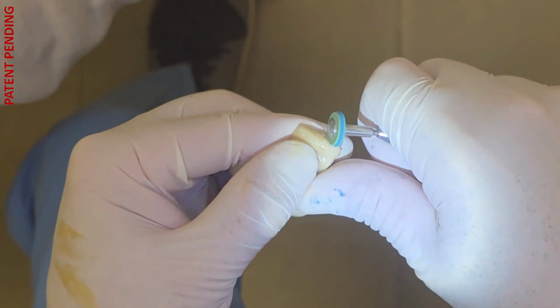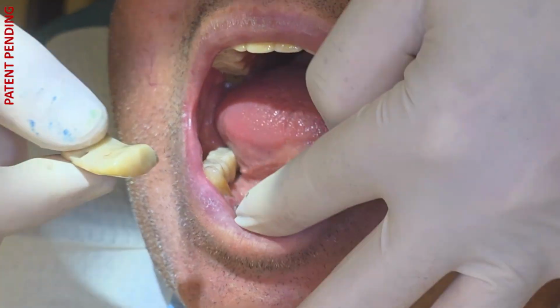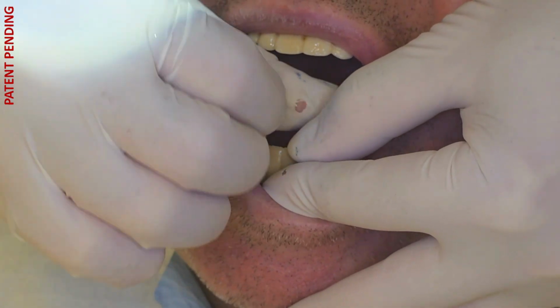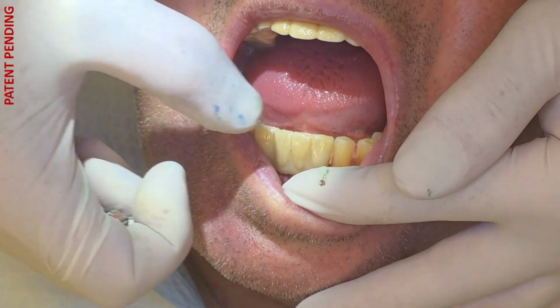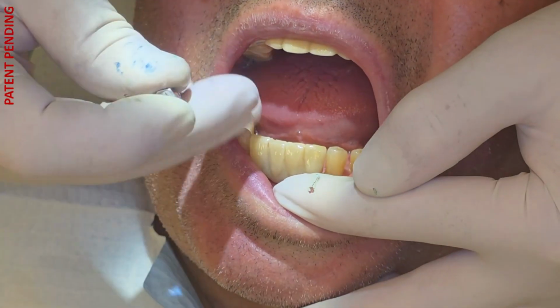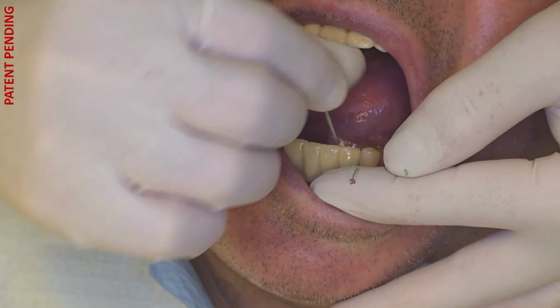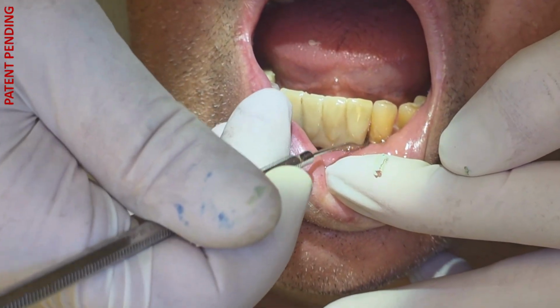We complete the surface refinement, polish, and finish. We proceed to final fixation. Once again, note, even when only one screw is tightened, the bridge does not move. This indicates a passive fit. A passive restoration does not create internal tensions, does not overload the implants, prevents screw loosening, and ensures long-term stability. This is achieved thanks to intraoral bonding of the sleeves. The gap between the crown and the canine is now ideal. The probe passes freely.